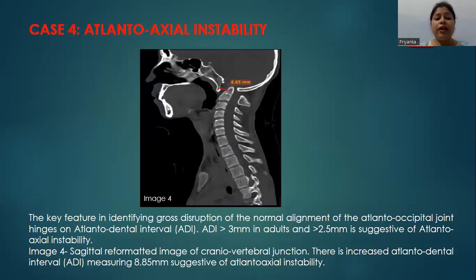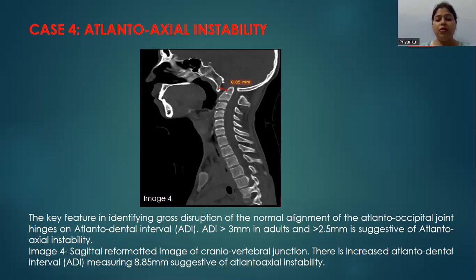The key feature in identifying gross disruption of the normal alignment of the atlantooccipital joint hinges on the atlantodental interval. An atlantodental interval of more than 3 mm in adults and more than 2.5 mm in children is suggestive of atlantoaxial instability. This image shows an increased atlantodental interval measuring 8.8 mm, suggestive of atlantoaxial instability.